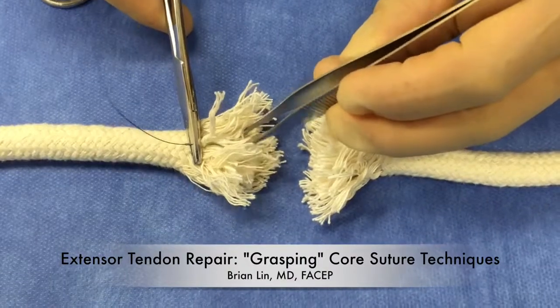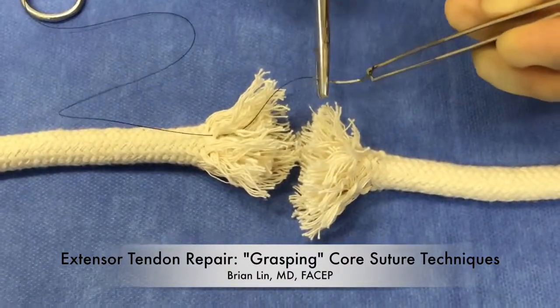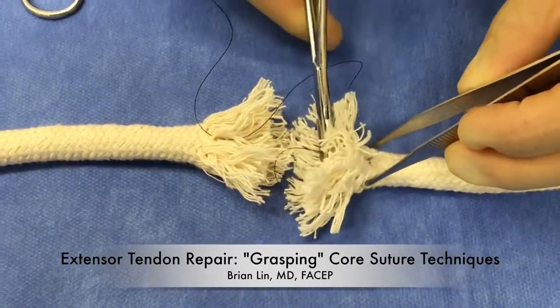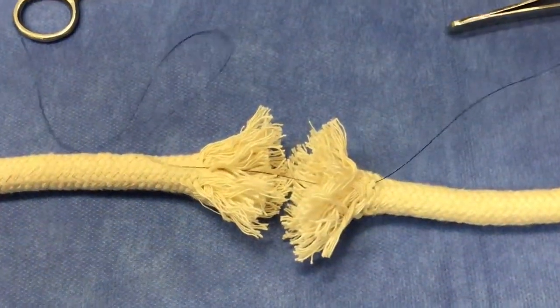In this video, I'm going to demonstrate using this model some techniques for extensor tendon repair which can be used in the emergency department. Specifically, I'm going to talk about some grasping core suture techniques. Now, why do we need these techniques?